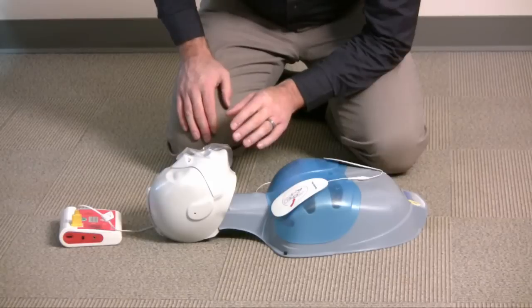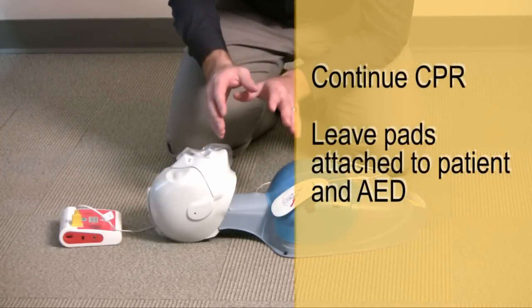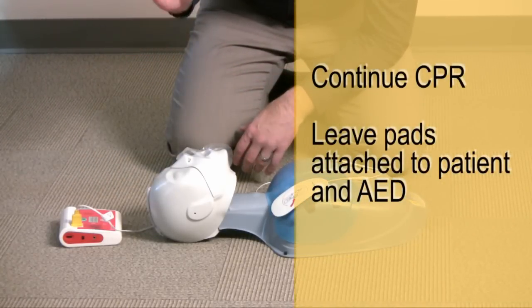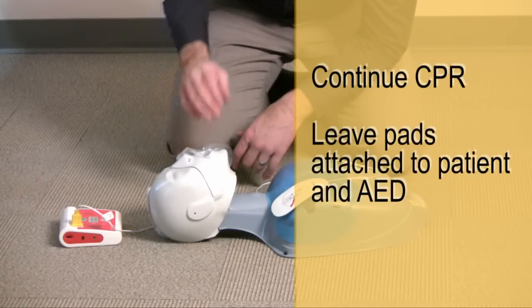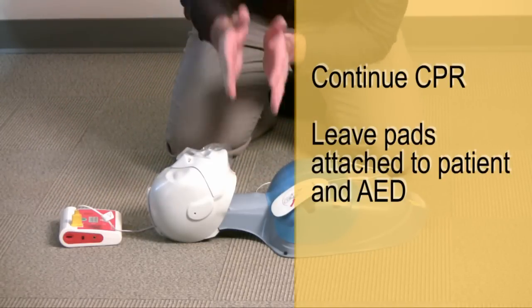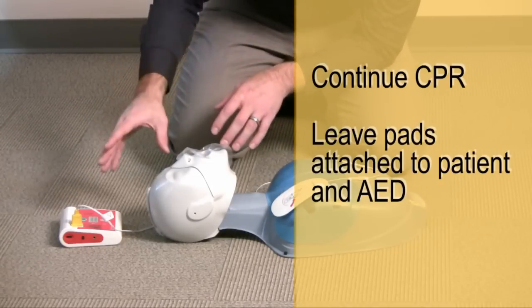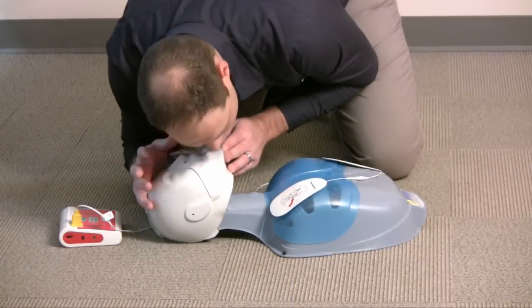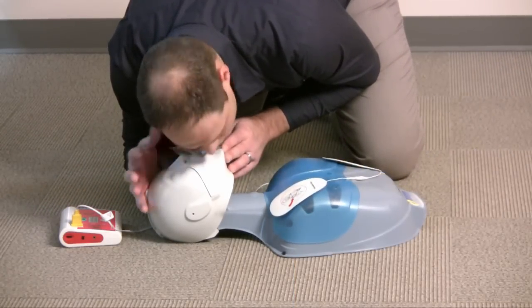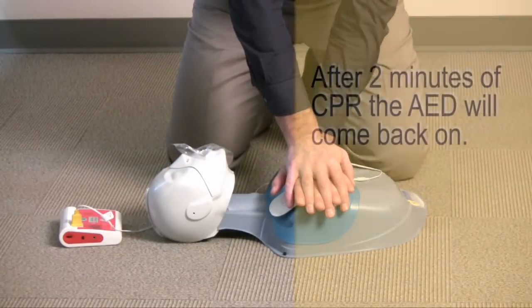So once the AED has delivered a shock, you want to go right back into doing your compressions and ventilations with CPR. Now, whether the machine delivers a shock or not, whether it says shock advised and you press the button, or it says no shock advised, going immediately into CPR is your next step. In this case, it delivered a shock. I'm going to start my CPR again. Both breaths in, and I'm going to continue with my 30 compressions.